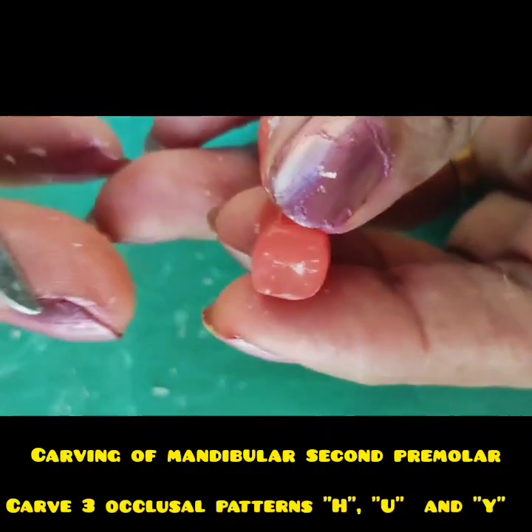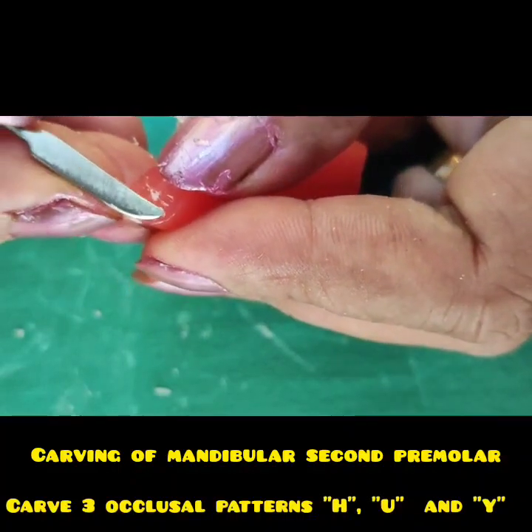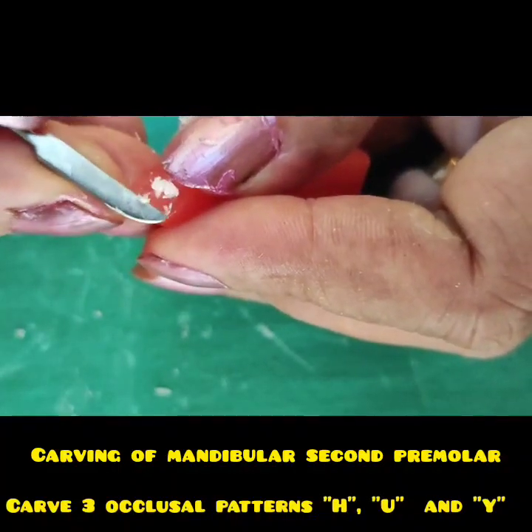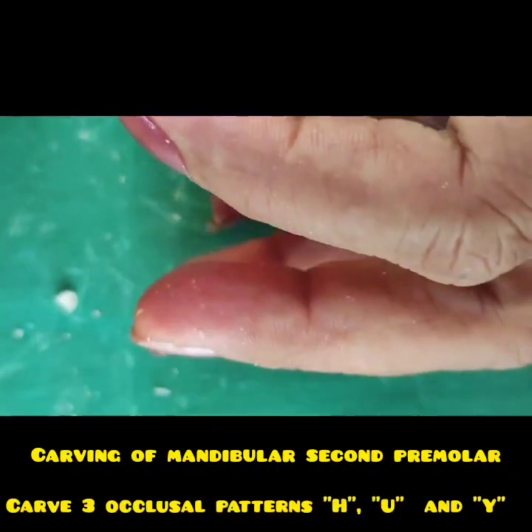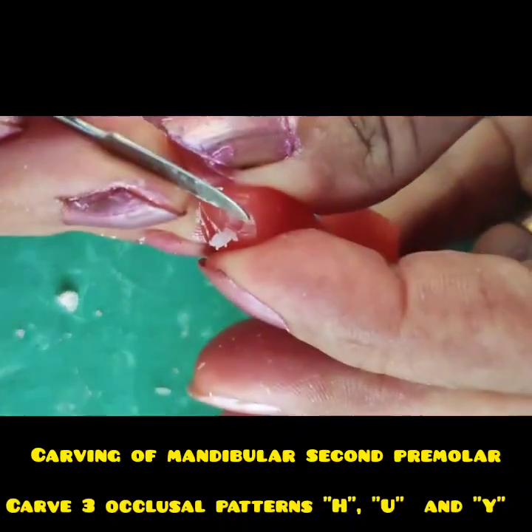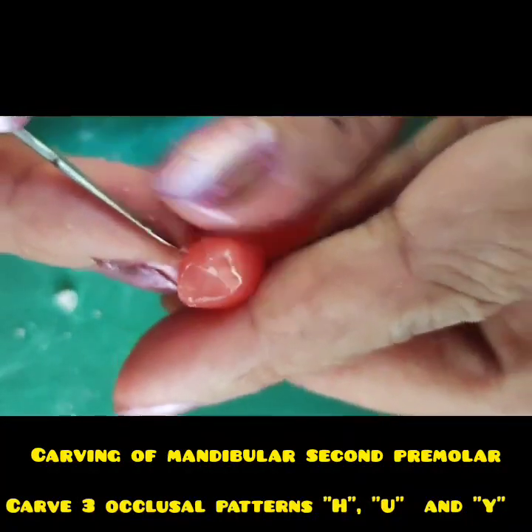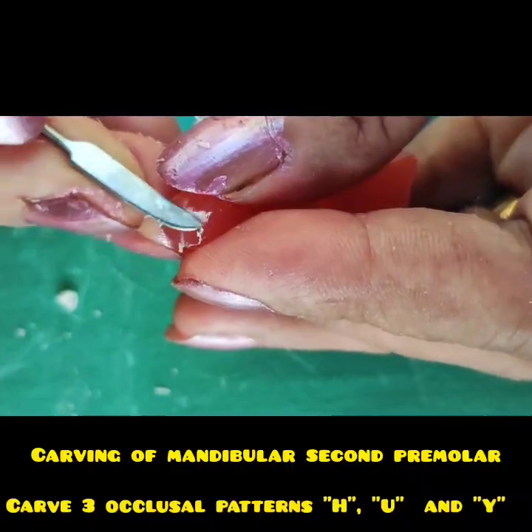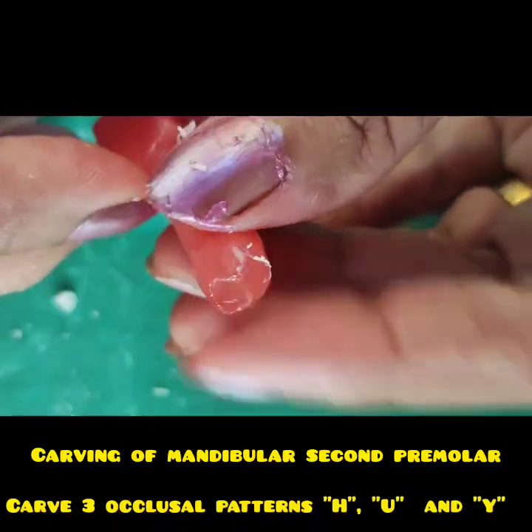So how to carve this U shape? First we have to carve buccal extension grooves like this. So buccal cusp, carve the buccal cusp, which is very easy, like this.